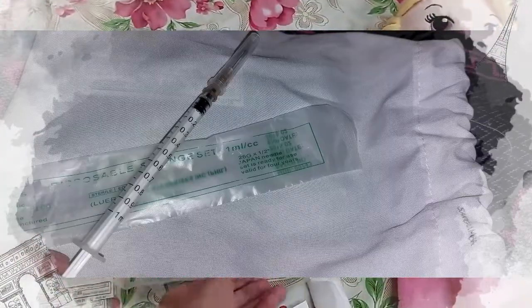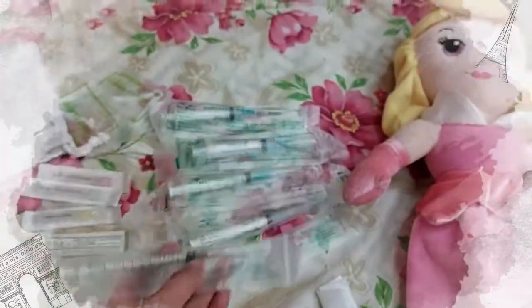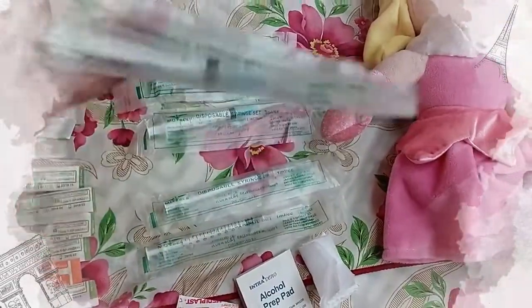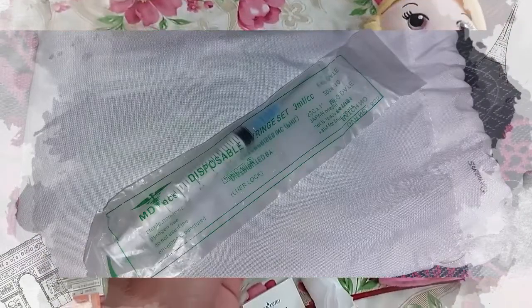For intradermal, I can use a 1ml syringe. I can also use 1ml for my subcutaneous and deltoid injections. I can also use 2ml for subcutaneous, and I can use 3 to 5ml for intramuscular — this is a 3ml syringe.